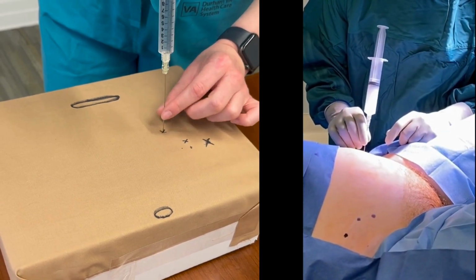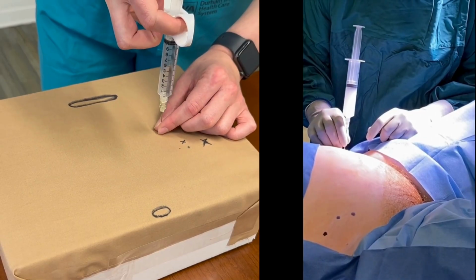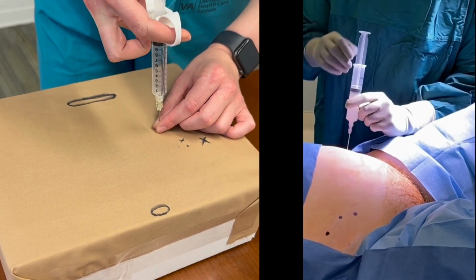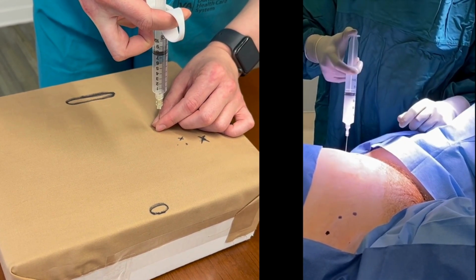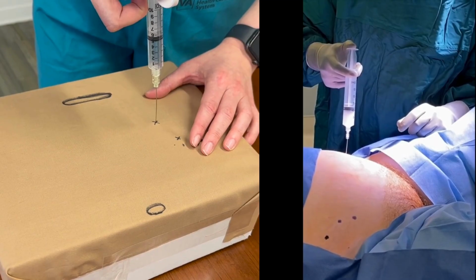You can see the trainee is able to identify the ASIS and insert the needle at the desired injection site. The task trainer recreates this tactile feedback, creating the opportunity to practice popping through the fascia and guiding the learner into the correct tissue plane.